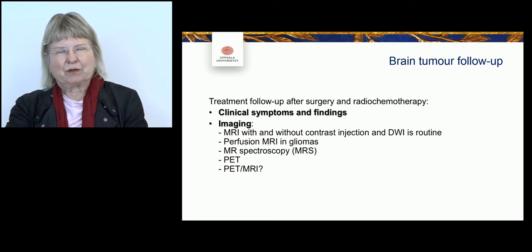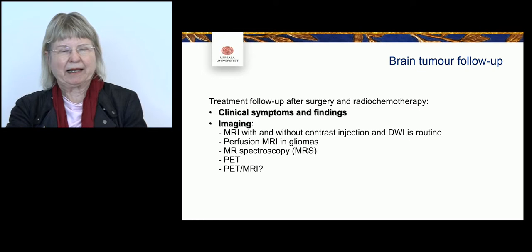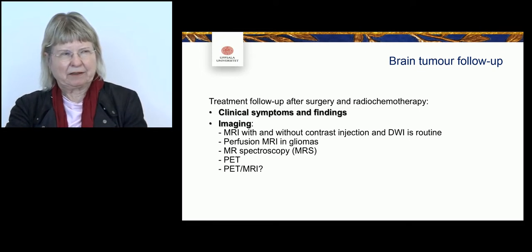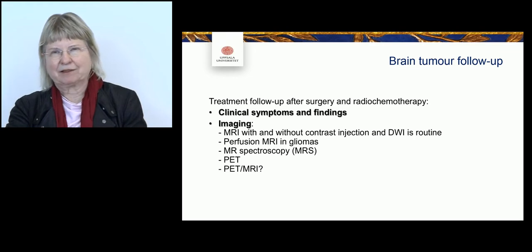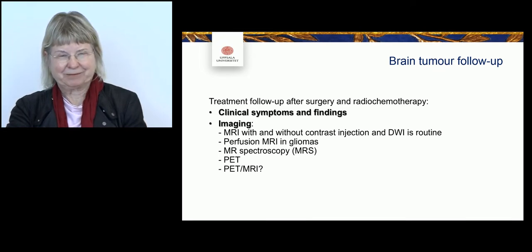We would, in cases with gliomas, always add perfusion MRI. We have MR spectroscopy that can be used as an additional tool. PET is a really good additional tool to help us, and maybe we could use the combined scanning with PET and MRI in a hybrid scanner.